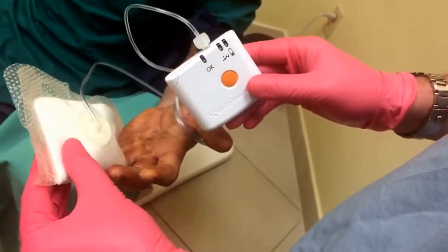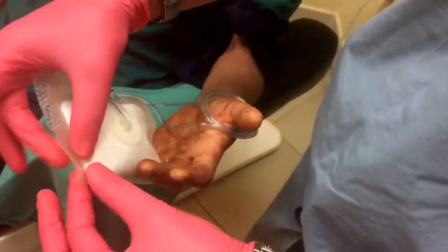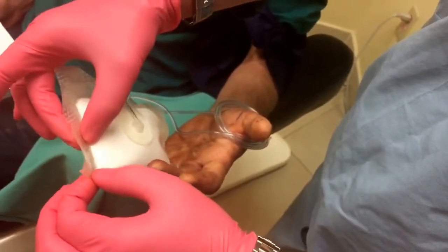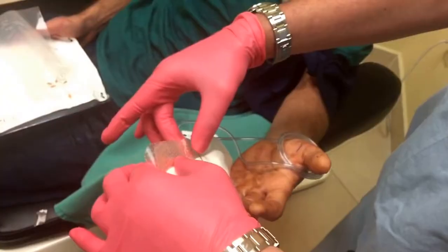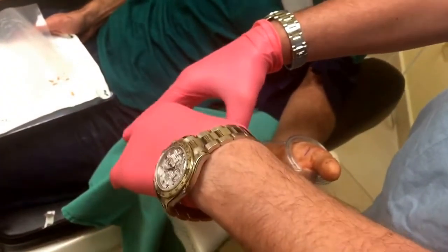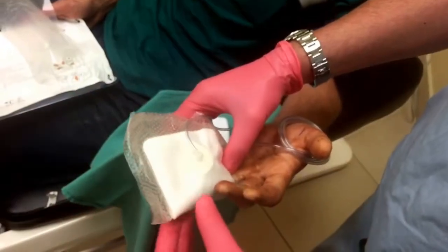You can see — and he can probably feel it suctioning. You feel it suctioning? Mm-hmm. Now we can help it out by pinching the ends like this. You feel it sucking? Yeah. Usually the patients, they feel the pressure.